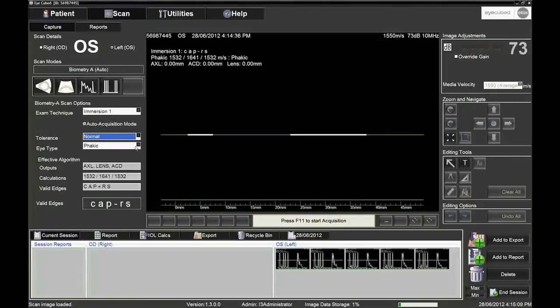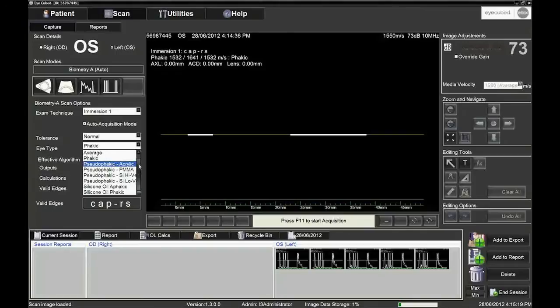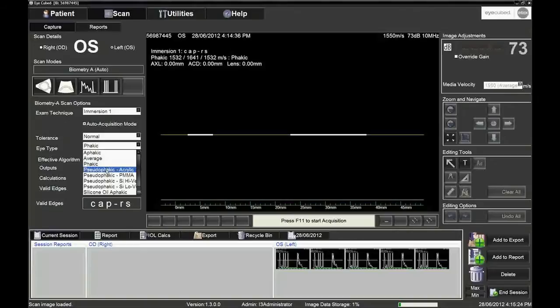For example, patients who do not cooperate or patients with staphyloma. The correct echo pattern will correspond to the chosen eye type: phakic, aphakic or pseudophakic, which will each have different valid edges or echo spikes.